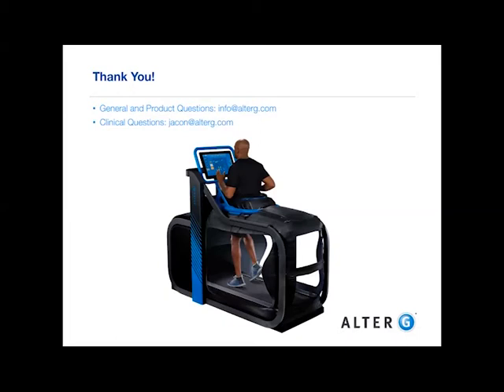Fabulous, thank you. Can athletes train for longer runs in the anti-gravity treadmill? Yeah, absolutely. We've got marathoners that do it. People that usually run outside typically don't like running on a treadmill. They find it boring, it's monotonous. But you absolutely can, and what they'll do is maybe hook up an iPad and watch a movie, or they'll find a way to make it more interesting. But yeah, you can be in there for extended periods. And again, you can get a training effect with less impact.